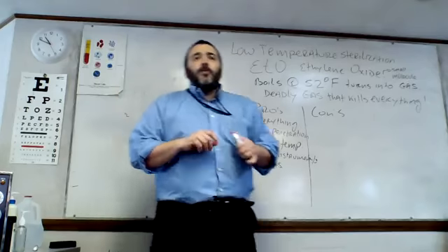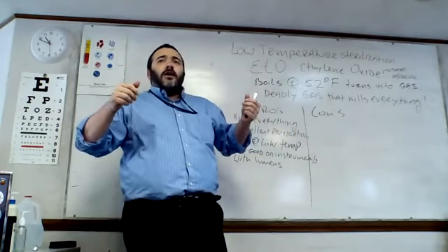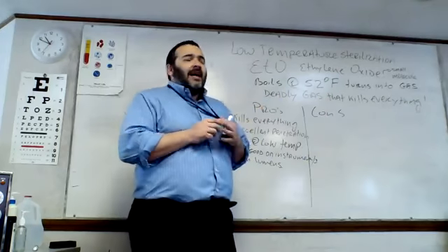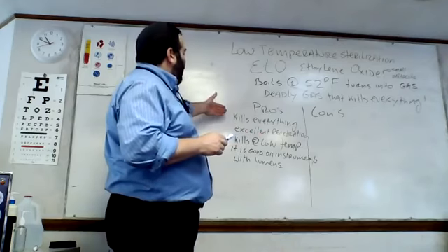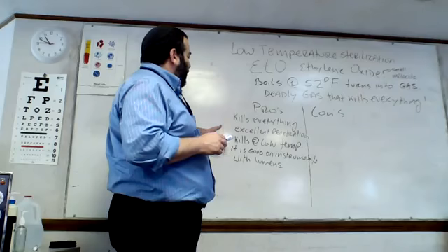Remember, an instrument with a lumen is like a suction catheter, right? Which has a long, hollow piece inside, like a tube, right? And you got stuff inside, ethylene oxide will get in there and will kill it. Okay? So we got pros so far. Kills everything. Excellent penetration. Kills at low temperature. It's good on instruments with lumens.